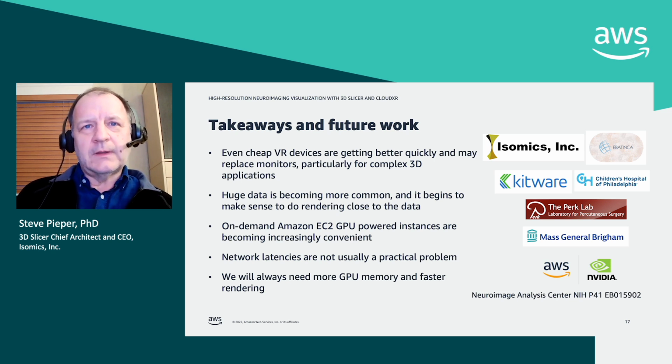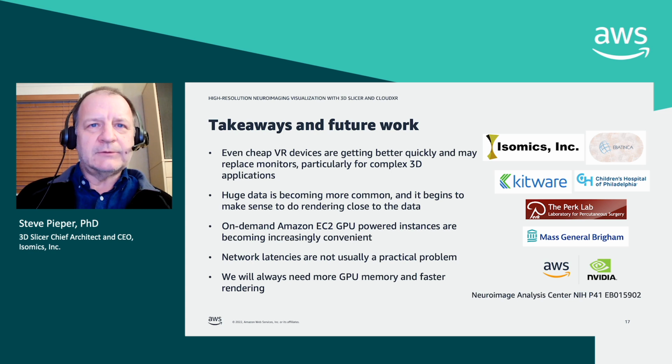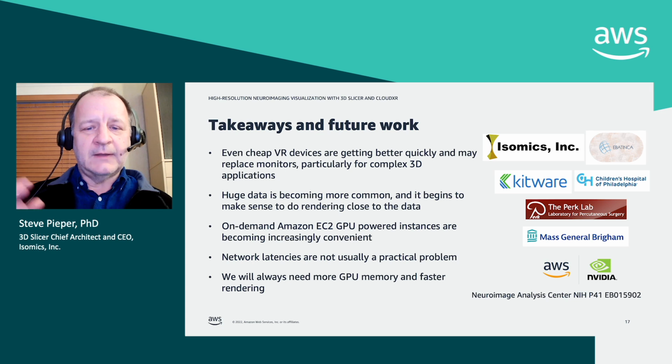We're in a number of research projects working with very, very large data sets. This brain is a good example, and it's public domain, so it's a good driver to explore with. But in other applications and fields, like micro CT and high resolution microscopy, there are a number of places where huge data is becoming the norm. And there is a kind of crisis in the field of matching the visualization tools to the size of the data. So being able to do high performance GPU based rendering where the data already is is potentially revolutionizing the ability to make use of all this data.